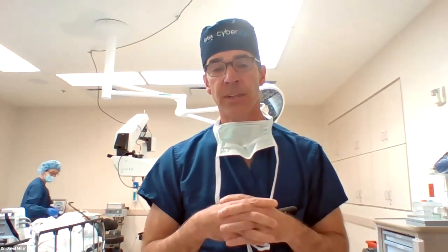The comparison of visual outcomes and centration of Gore-Tex versus the Yamane technique. That's a very good question. So this lens, you can definitely play with the centration back and forth, and it doesn't have any tilt. The Yamanes, I've seen some of those tilt, right? They get a little like this or something, which I know can throw off optics, but it's a big lens implant. I think it centers really well. I do not know of any literature or studies having been done to compare those outcomes. We are going to be looking at that probably this year and next year with some other groups in the country to get the outcomes, complications, and even refractive outcomes for these cases.